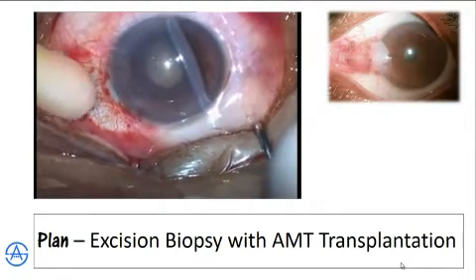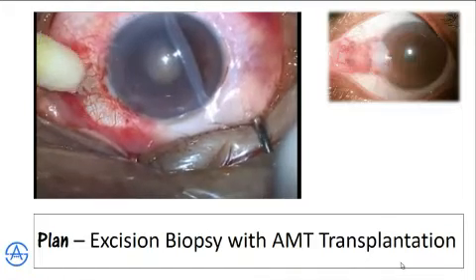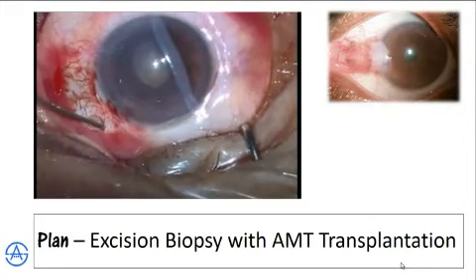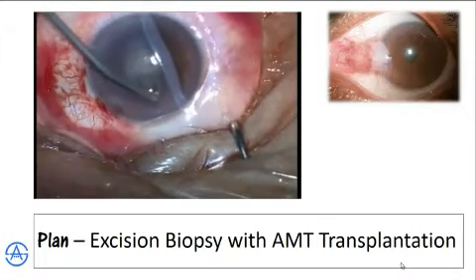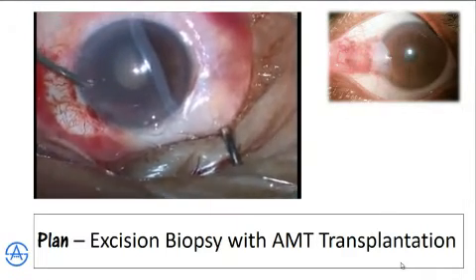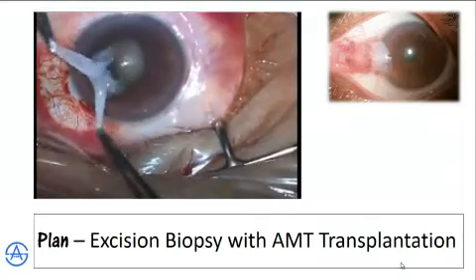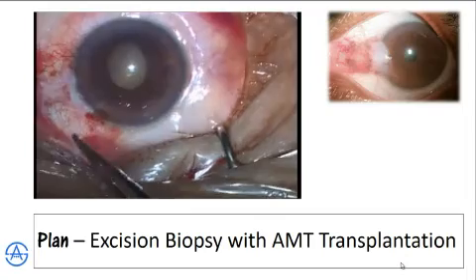The thrombin part of the fibrin is placed over the conjunctival side as it's in a more liquid form. The thicker fibrin is placed over the amniotic membrane. Then the amniotic membrane is replaced over the defective area.